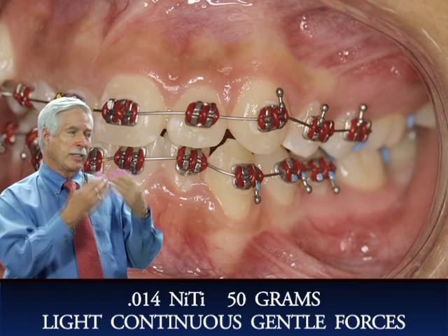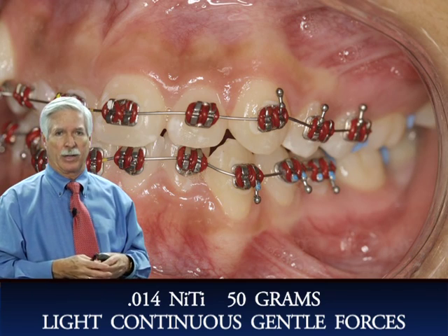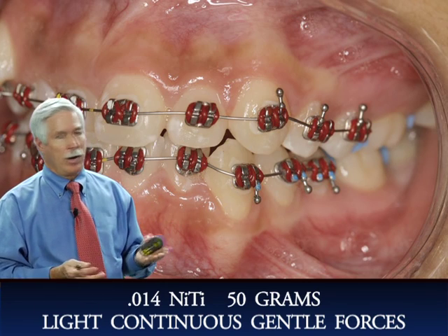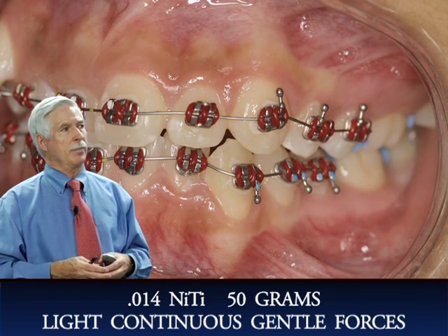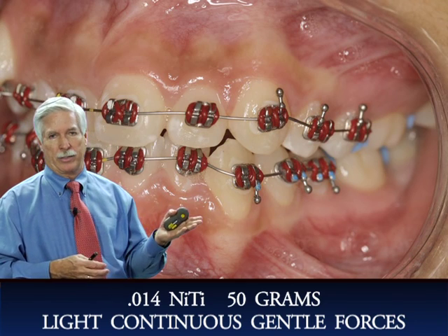So the patient's just had the brackets on. I really don't want them to experience any discomfort. The most they'd ever have to take is maybe an aspirin at night, but not a lot of discomfort, only 50 grams of force. Very nice appointment, probably in for 40 minutes.